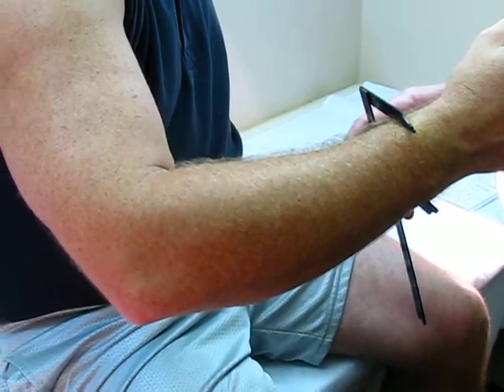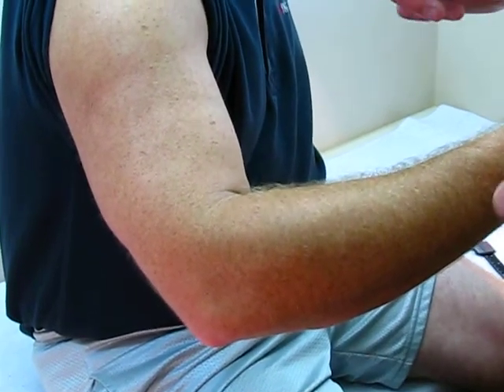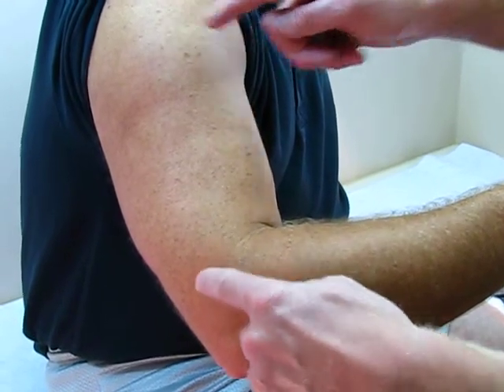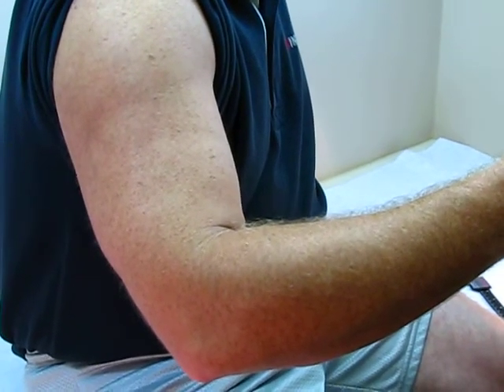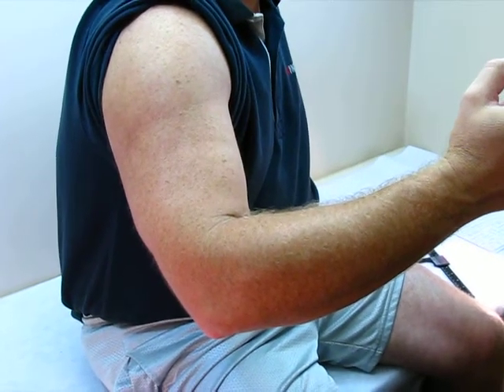Remember, since this is a custom elbow orthosis, if you do not specify how long you want your humeral and your forearm arms of the brace, Ortho Innovations will make it standard 7 inches. We want them long enough so it doesn't impinge on the axilla.